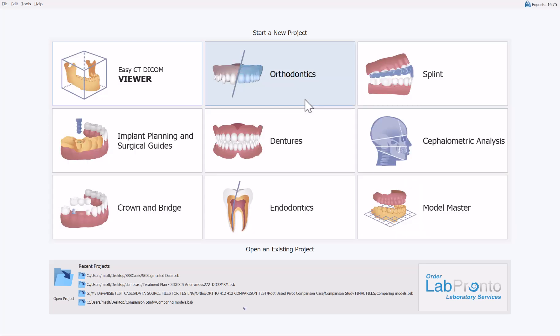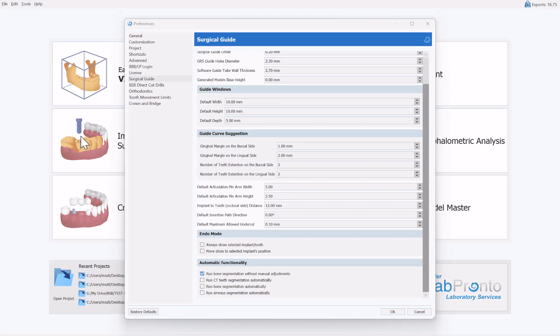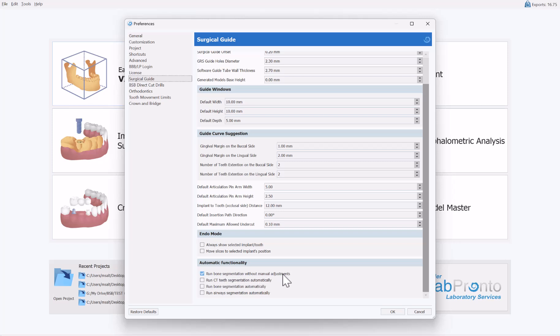I'd like to focus on the different options accessible via Tools > Preferences regarding when segmentation functionality should run automatically. Here I accessed Tools, chose Preferences, and clicked on Surgical Guide. If you scroll to the bottom, you can see the section for automatic functionality. The first checkbox is 'Run bone segmentation without manual adjustments.' Keep this checked if you want segmentation to run from beginning to end automatically.